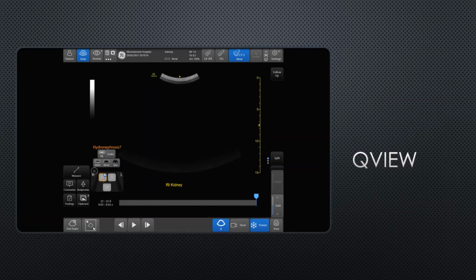Now, we do have the ability to do the interpretations directly on the machine and also submit for QA directly on the machine, or rather sign them. We used to use the submit for QA button, but we don't anymore. You should not be using this when you're on a scan shift if there's a resident scanning, because you can't add them from there, so you want to make sure that you use the full QPath.